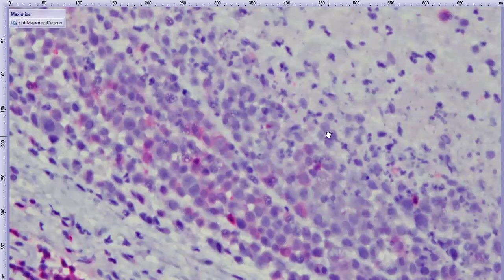And because of the multifocal distribution and carpeting of intraocular surfaces, it is strongly suggestive of a tumor that arrived at the eye from some other site. So good to check out the cat for something else going on in the body.